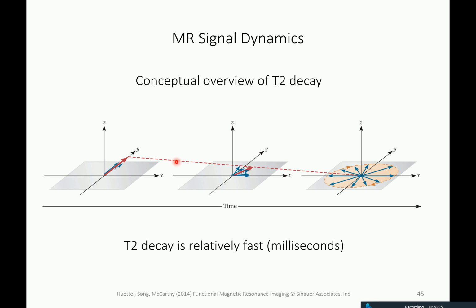The important thing is that the net activity in a given direction gets smaller, so this red arrow gets smaller, and at one point, if all these little nuclear magnets are not spinning in phase anymore, the net magnetization is really low because they point in all sorts of directions. So that's shown here. The reason they lose phase coherence is that each of them has a magnetic field that affects the other one. But they all stay in this transverse dimension.